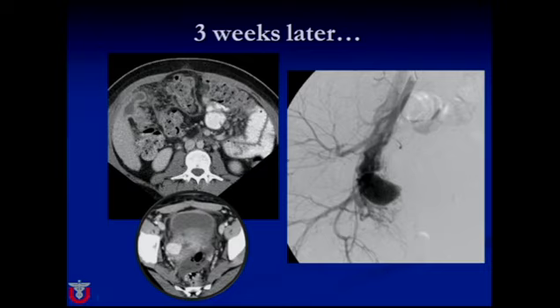She was treated aggressively with antibiotics, and her overall condition improved, but she developed these loculated abscesses. And my IR colleagues were consulted to place a drain. And again, they found this large thing in the pelvis, and funnily enough, the ureter can't drain because of this big vascular structure. So we persuaded the clinical team to allow us to investigate that further.